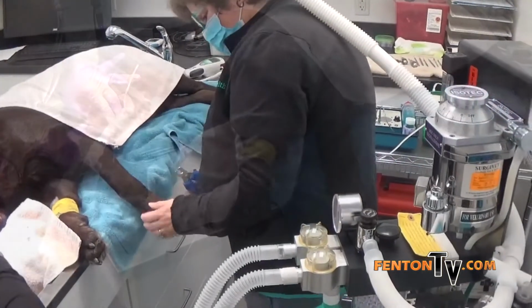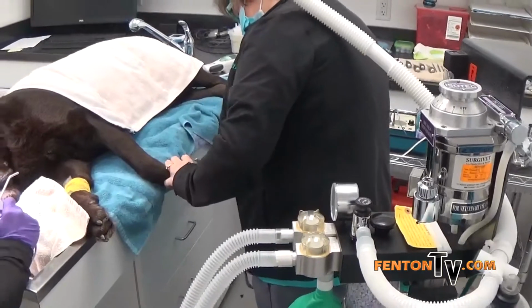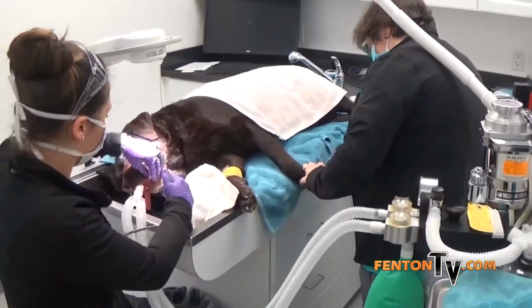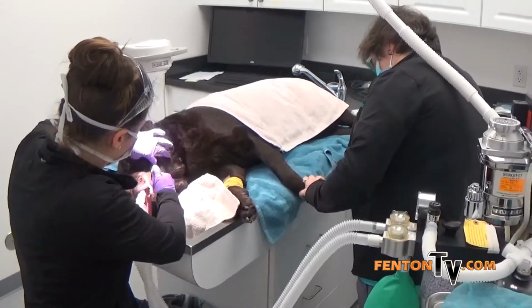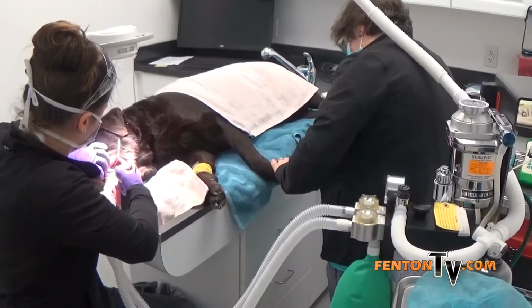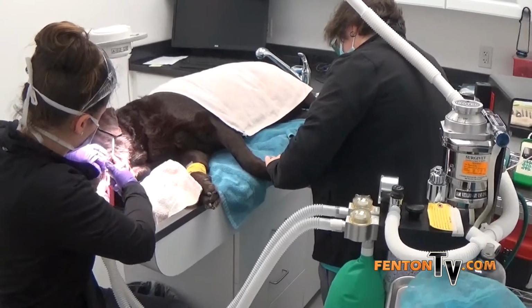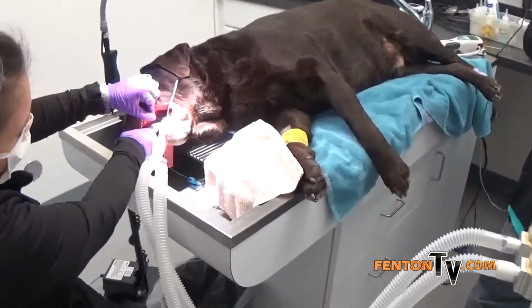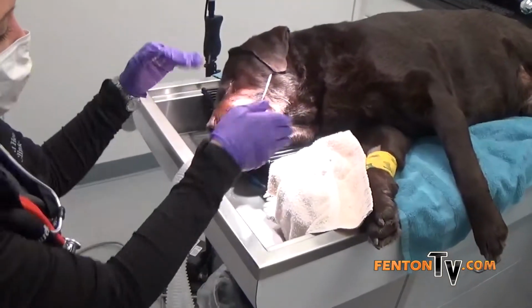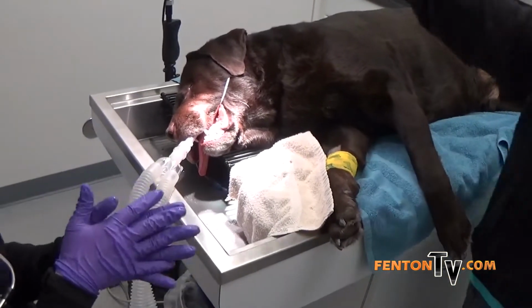Getting the mani-pedi while he's under too? Yep. Every anesthetic procedure, we trim their nails and clean their ears. I'll do the top of this side and the inside of the bottom, and then I flip it, I'll do the top of that side and the inside of that bottom, and that covers all of its quadrants.